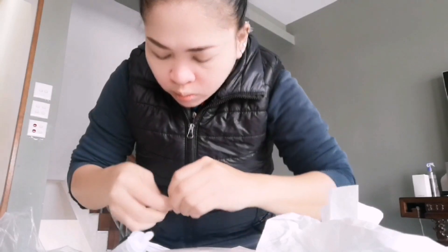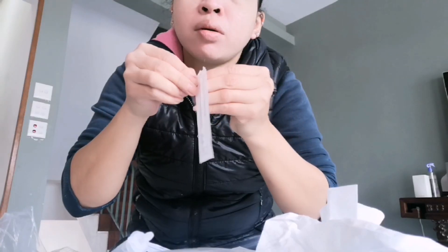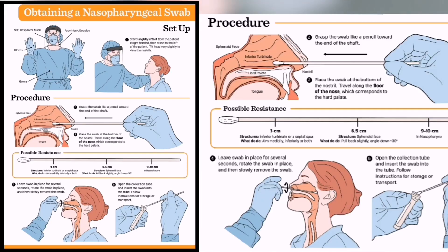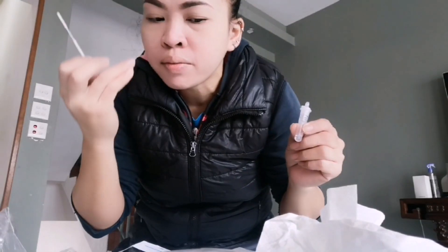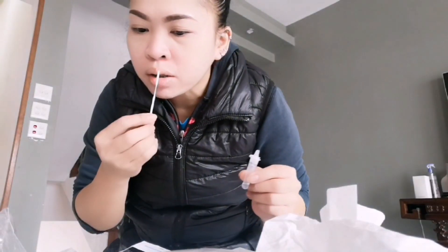Take your swab sample. Insert the fabric end of the swab just inside the nostril about 1.5 cm. Then gently wipe the swab around the inside of the nostril in a circular motion five times for at least five seconds. This is a scary time — I hate it. Ganun din yung gagawin sa kabilang nose. Sinutusok na po — tinutusok na.